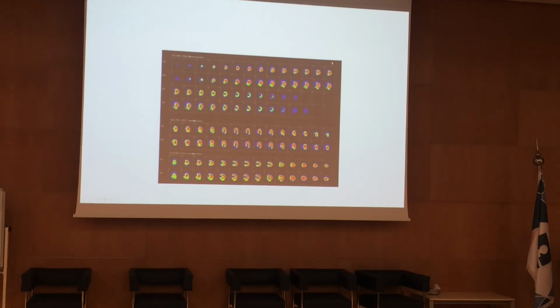And compare stress part to rest. If there is a defect in the stress and normal rest, that means ischemia. If there is a defect in both, the same, it is going to be scar. If there is no defect, it is normal. Okay.